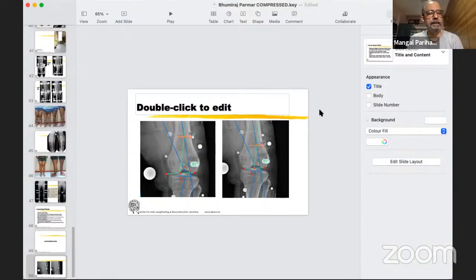Good. So I think that is a good exposition. We get a lot of these patients, and this is a standard way that we do it now, where we do the femurs with a nail and the tibia with the fixator, so that we can then balance out whatever is required.